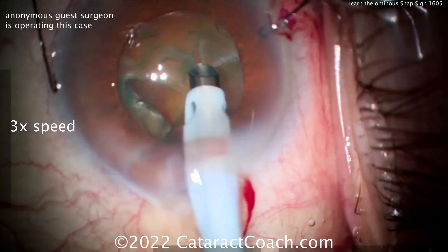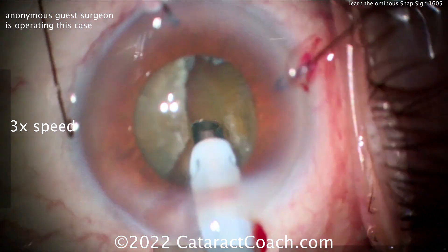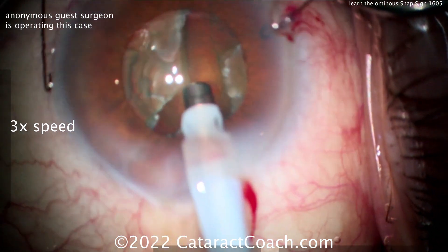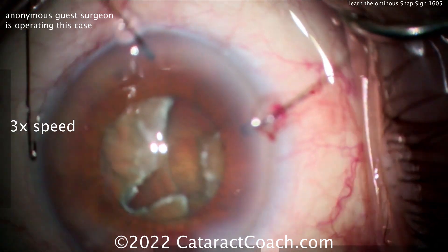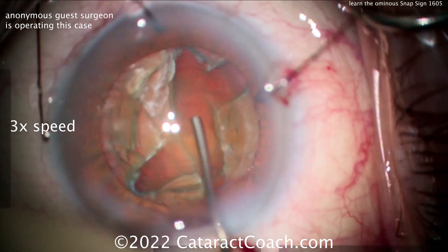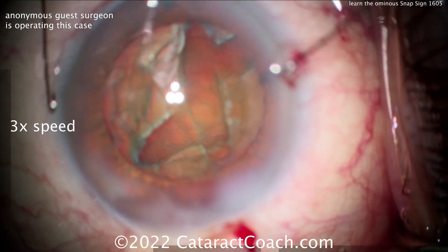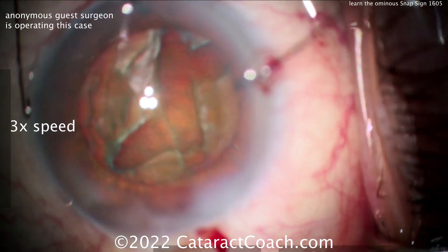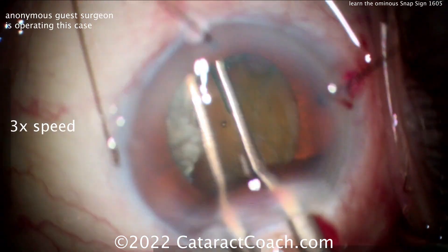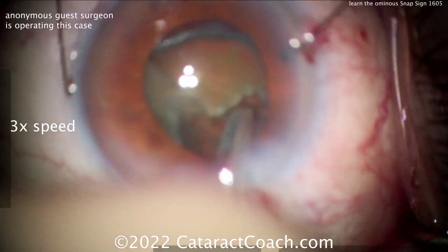Way too much movement here. You can see it's just not being supported; it's hard to create the groove. The whole nucleus wants to move. This is a case where converting to MSICS is a good idea. More viscoelastic — but look how deep it is there centrally. That's because the nucleus is being pushed away since there's no posterior capsule to hold it. Very shortly, watch as the infusion pressure goes inside the eye — trying to crack it. A case like this, it's already done; you want to convert to MSICS.